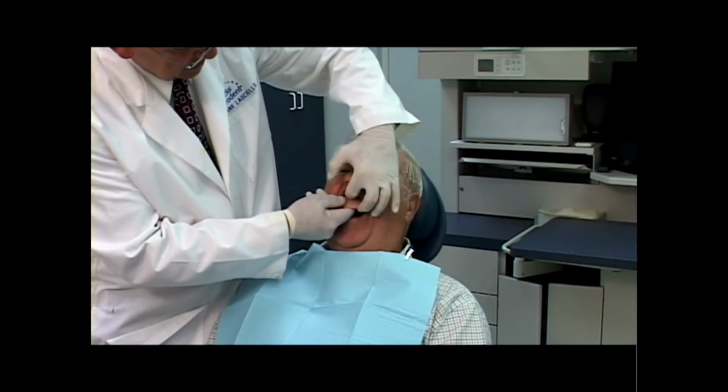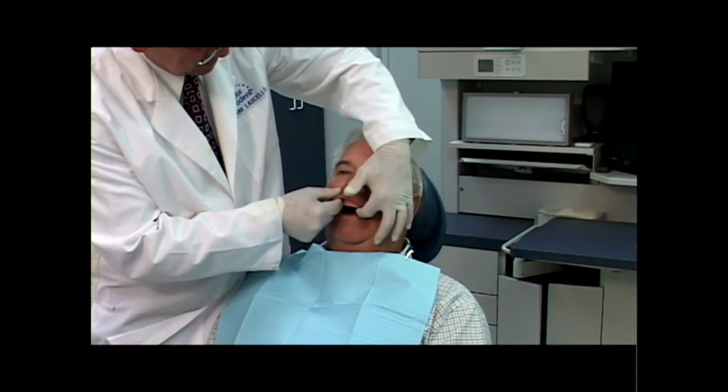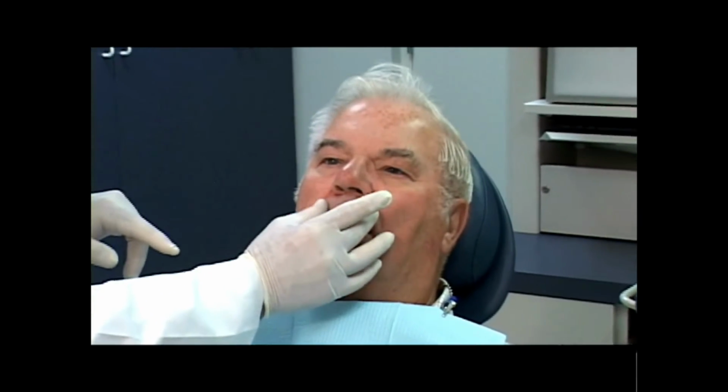We're going to try in the wax rims and have the patient relax his lips. Typically, I like to have the patient count 1 to 10 or to have them converse in a casual conversation so that we can evaluate the incisal length of the wax rim. 2, 3, 4, 5, 6, 7. I think we could agree that the rim is too long for our patient, so I will mark where I think the rim should end, and we will adjust the wax to the desired length.